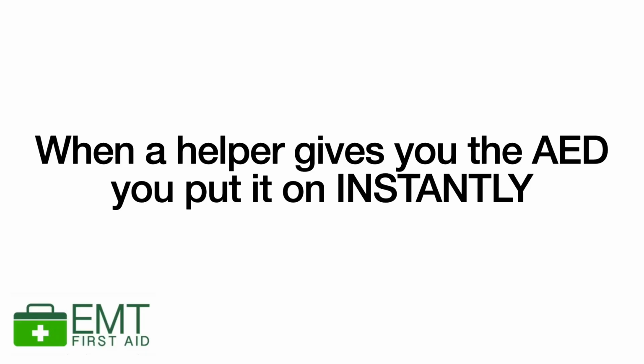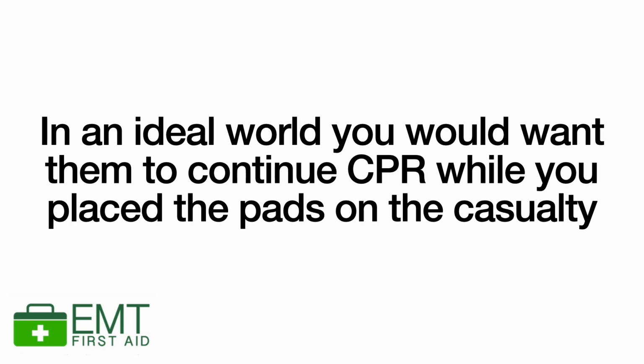Now, when a helper returns with the defibrillator, with the AED, we need to be able to put it on instantly. In an ideal world, we would like the helper to carry on with the CPR while I put the defibrillator on, because the aim is to get it on without a delay in CPR. You do not want to be off the chest for too long, but at the same time, you also need to get that defibrillator on quickly. In this example, I am going to be putting the defibrillator on. The helper is just going to hand me the defibrillator.